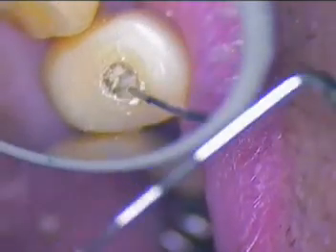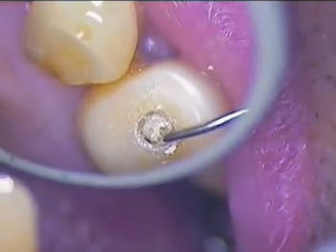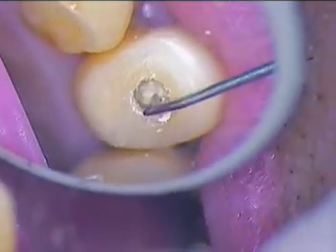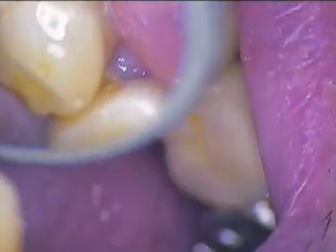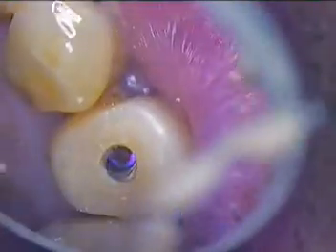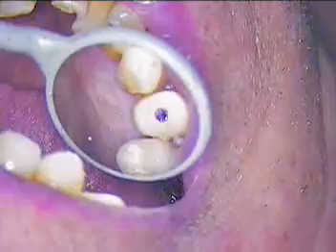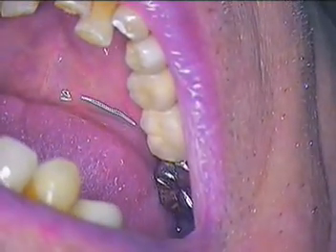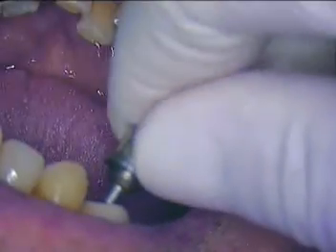I'm going to reverse that. Let me have a small scaler — I need a little hook on the end of that explorer. Let's see if we can just pull that out of there. See if I can spin it with the round burr. What you're looking at right now, all the way down there, is the screw head of the PEEK abutment. We're going to use our little wrench and go ahead and get all the way down in there. There's our driver — that's a star driver.